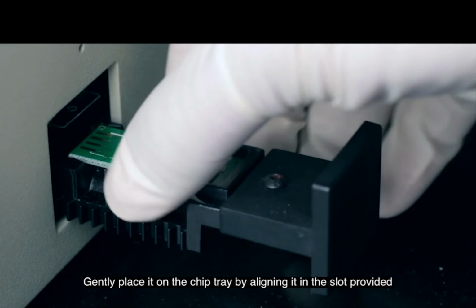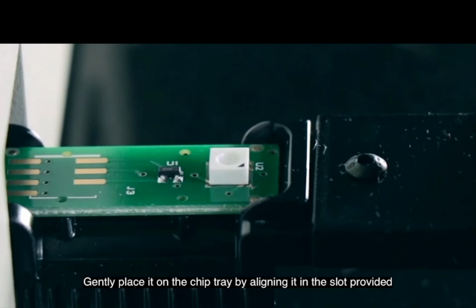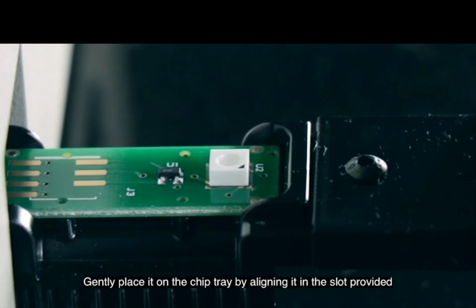So place it here in this particular orientation. Okay, the well will be outside, away from the machine, whereas the other part will be inside. There will be small connectors in it, so you can see the hole. It will nicely sit in that particular place.